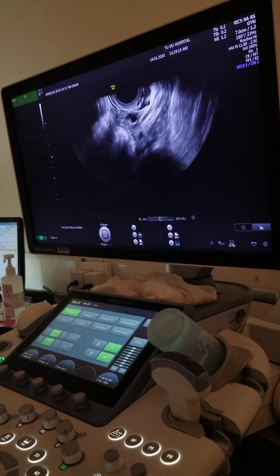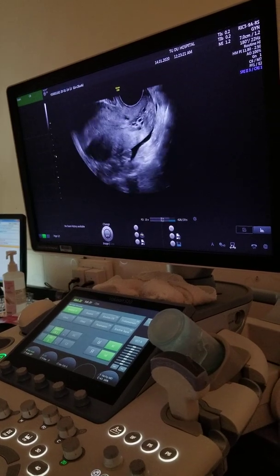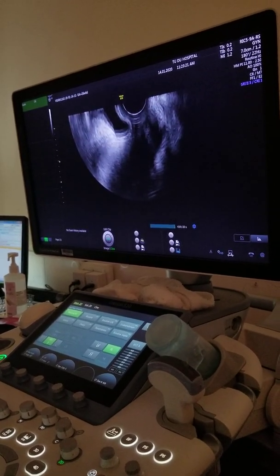Yeah. And here's the other ovaries. Sure, normal. Yeah, normal. Okay, good. Yeah. So look, it's like a normal uterus. Maybe we will find one with that normal.